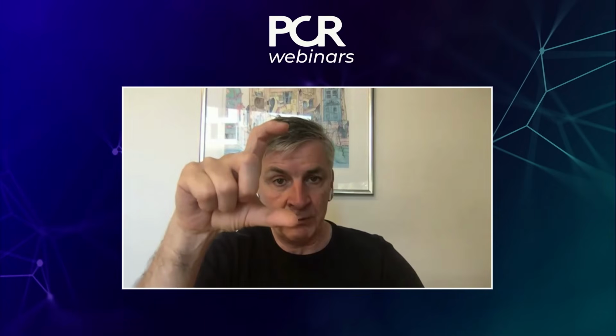And I would strongly recommend doing it just when you have the delivery system just above the aortic annulus, just before you cross it. And when you are aligned, you cross it and deploy it. Some sites will argue for going back to the descending aorta and doing your torquing. But I think crossing the arch again and again, I would have concern about that. So I would stay where we are. And again, our experience so far is without any complication.